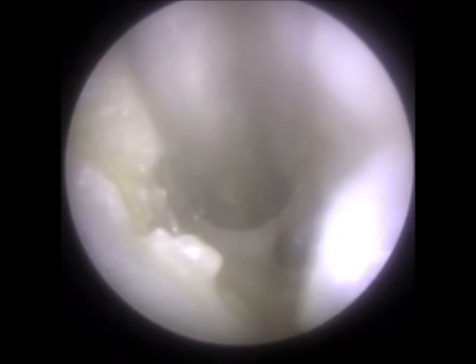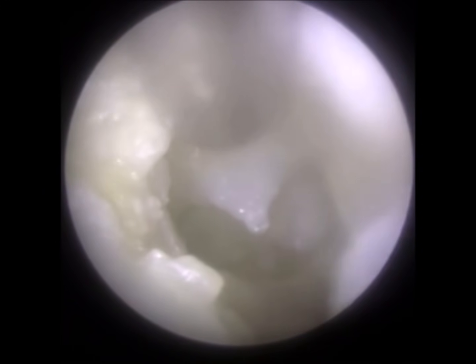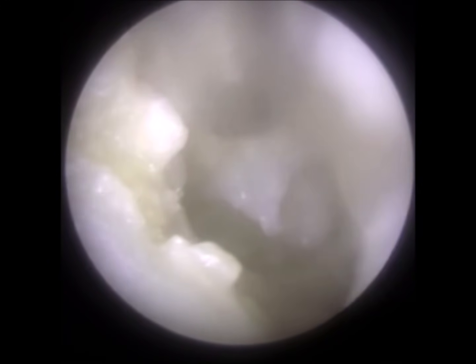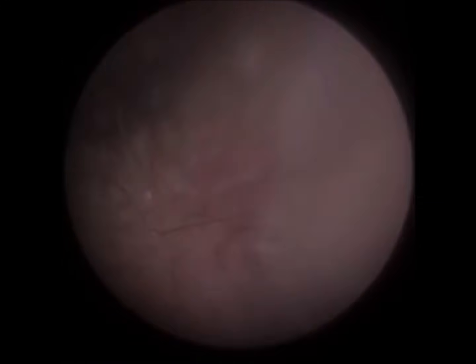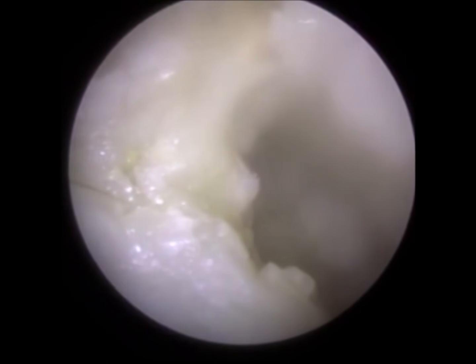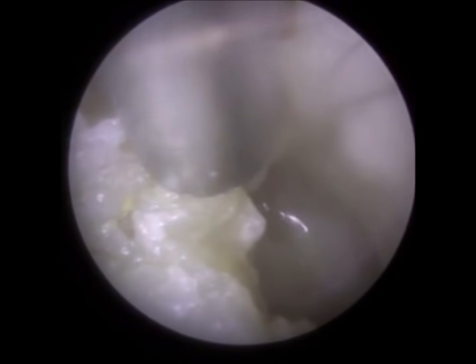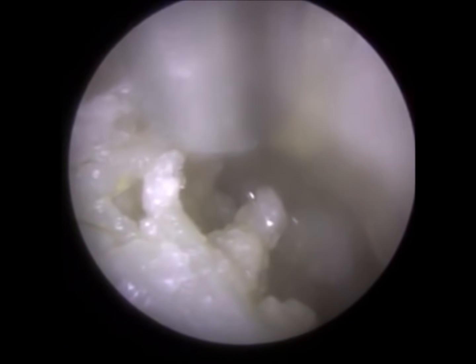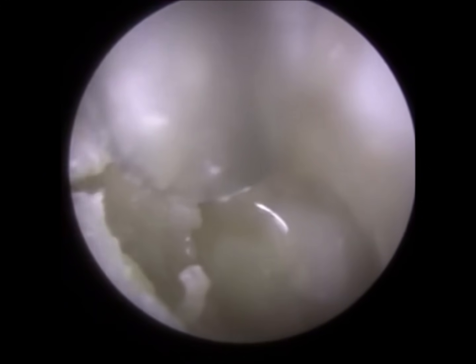But at this stage, I wasn't aware of the erosions. All I'm looking at is straight ahead at his ear canal, towards his eardrum. So at the moment, yes, the ear doesn't look natural. It's infected, a lot of discharge, a lot of dead keratin, but I wasn't aware at all of all the other problems this patient had until I started removing layers and layers of this dead keratin from the gentleman's ear.